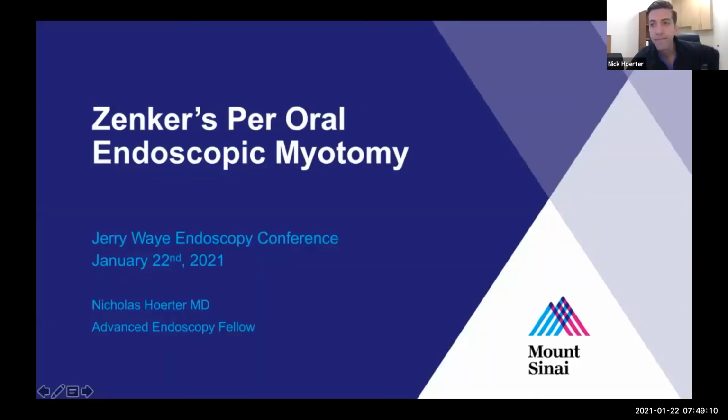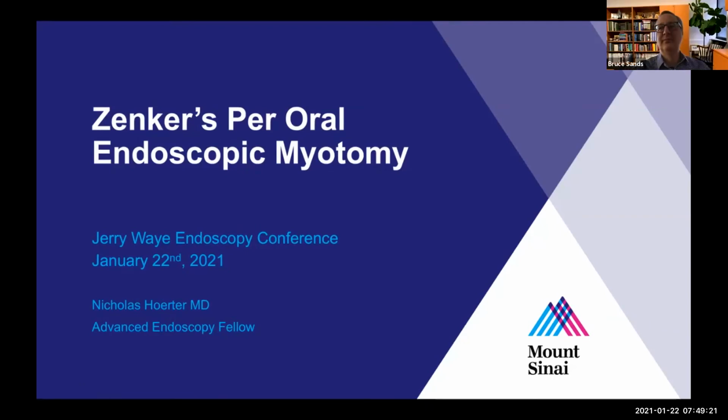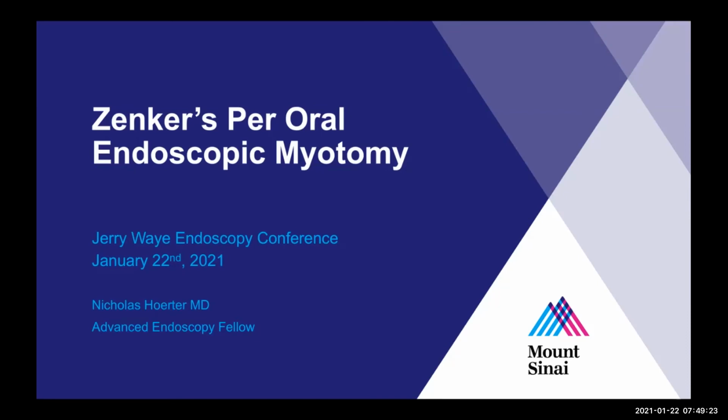All right, thank you. In a very different vein, I have a more procedurally oriented case here. This is Zenker's case, and we performed a Zenker's per oral endoscopic myotomy, which I'll present.